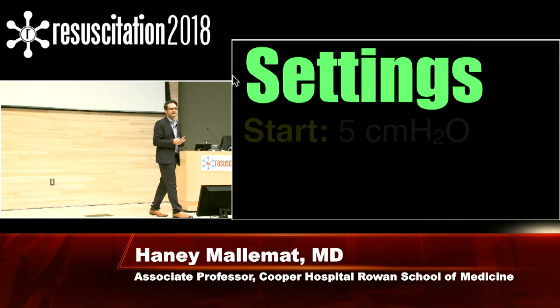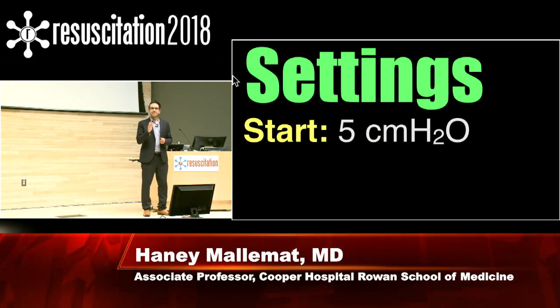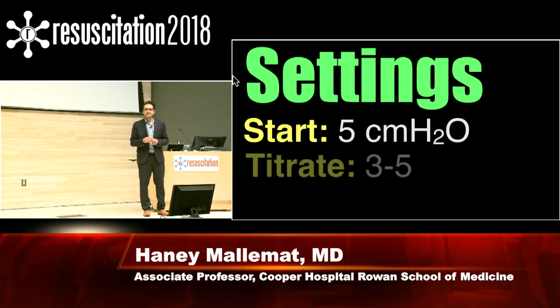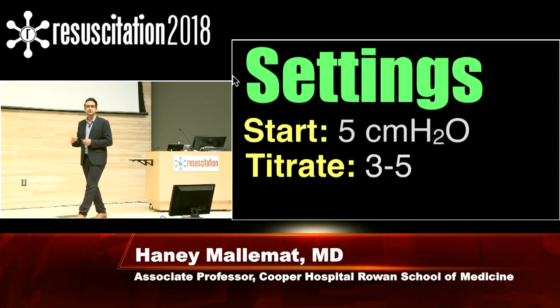So how do you start off your CPAP? How do you start your initial settings? You can start at 5. Why 5? That's just the number that people do. If you want to be snarky and start at 4, have at it. But start somewhere. But that patient that's sick, you're not leaving their bedside. You're going to sit by them every 10 to 15 minutes and increase by 3 to 5 centimeters of water.